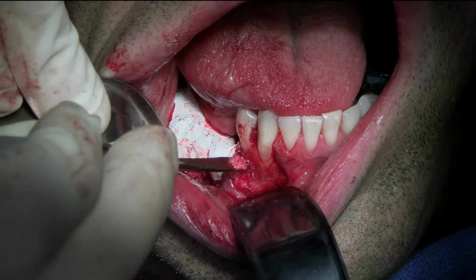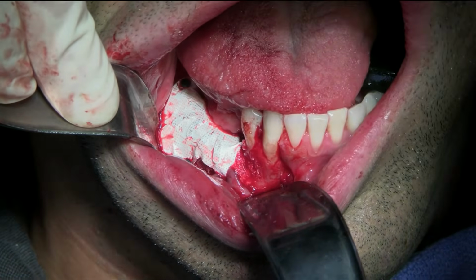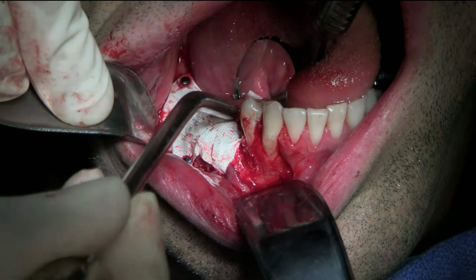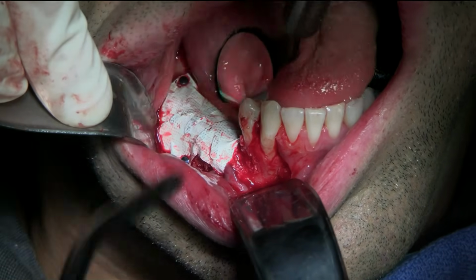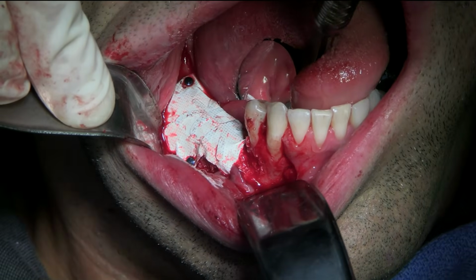Mohamed, we're getting slowly to the end of the procedure, okay? Let's do a mirror so we can see the occlusal.